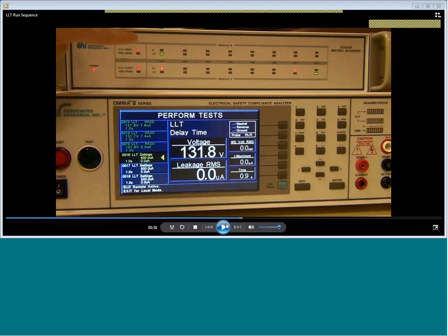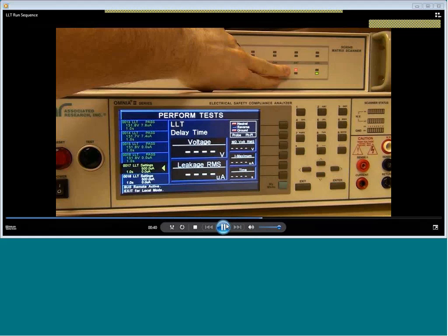Now over to the left-hand side of the scanner, you'll also see I've set channel 9 high. So now that I've set channel 9 high, I've essentially shorted it to probe high. It would be no different than me manually taking the probe high connection and connecting it to a patient lead. Then you'll see also that I have channel 1 set to probe low. That would be no different than me taking the probe low lead and connecting it to yet a different patient lead. So if we just say channel 9 is patient lead 1 and channel 1 is patient lead 2, I'm just taking probe high, probe low, connecting probe high to patient lead 1, probe low to patient lead 2, and taking a measurement. And I could do this for any number of patient leads I have connected here.